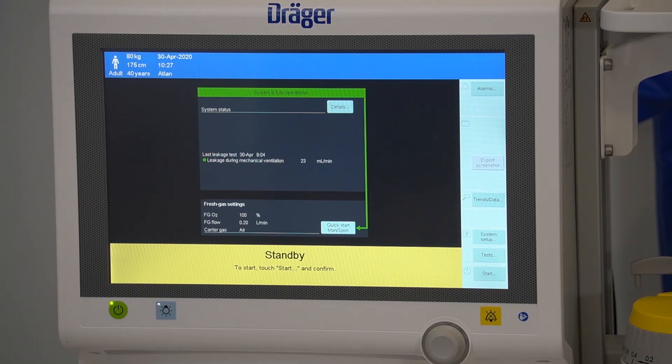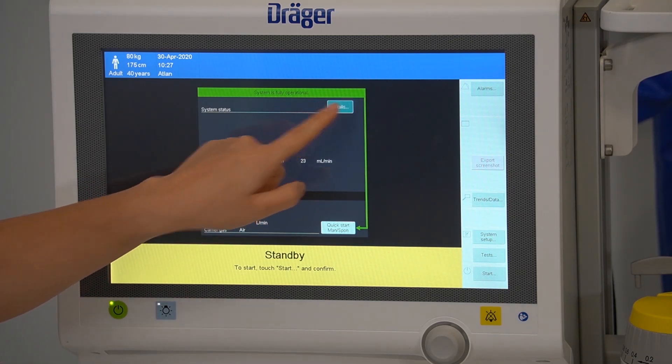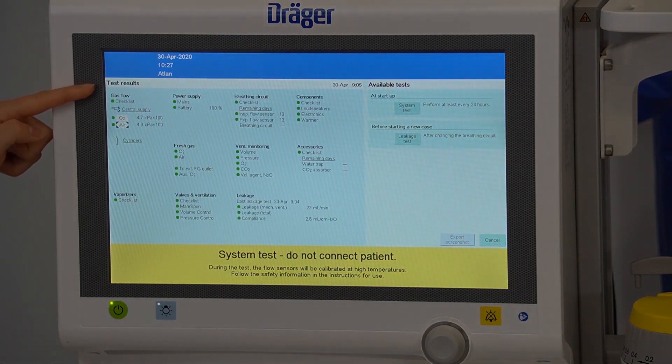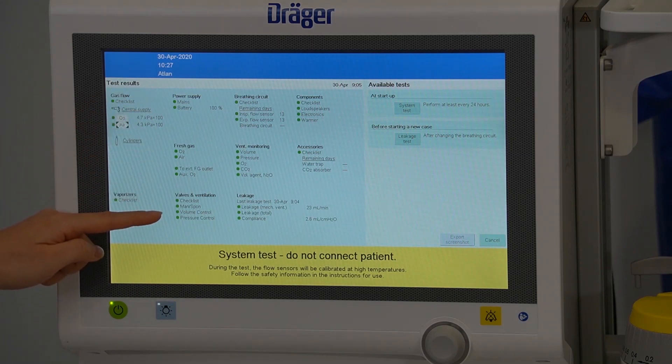To bring up the results or details of your system test, select details. The steps of the system test are listed with the relevant colour-coded results against each step. To return to the main screen, press cancel.